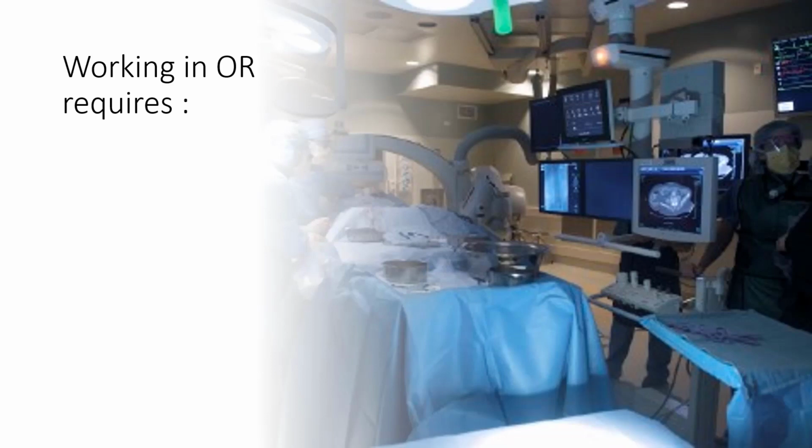What about working in the OR environment is different than working in trauma or the ICU or the NICU? Well, when you're working in OR, the main thing is it requires a super awareness of sterile environment. You need to be skilled in the use of your portable machine and C-arm. You need to be able to place the equipment correctly and in the most efficient manner around the OR table, which houses the patient.